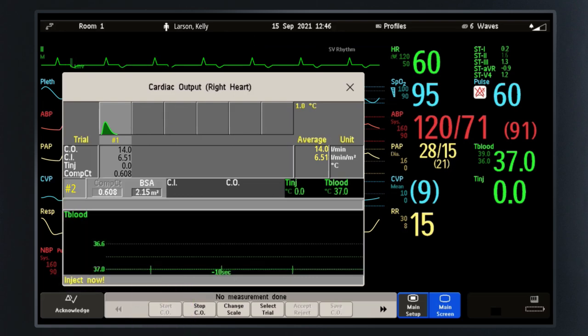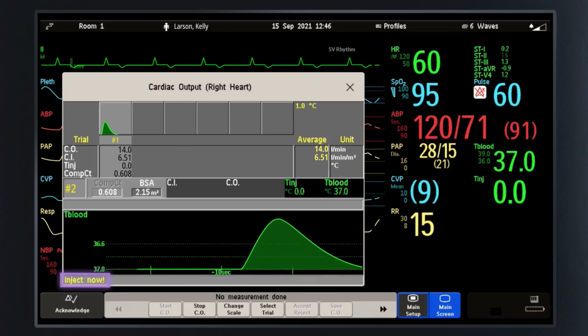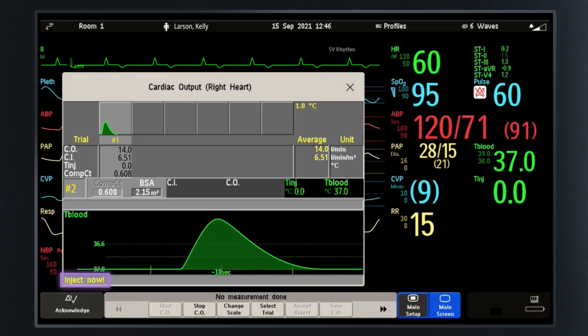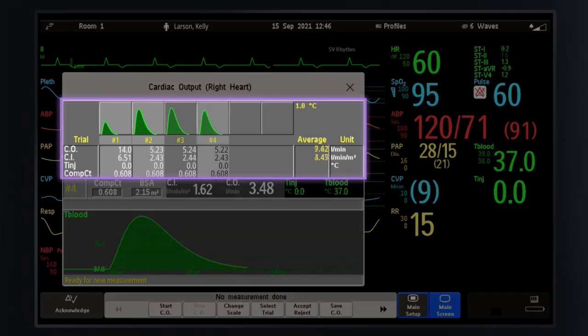Select Start CO to begin a new measurement. Again, you hear a ready tone and see the message 'Inject Now.' Follow the prompts to repeat the same steps as the first measurement. You can perform a maximum of six measurements before editing.